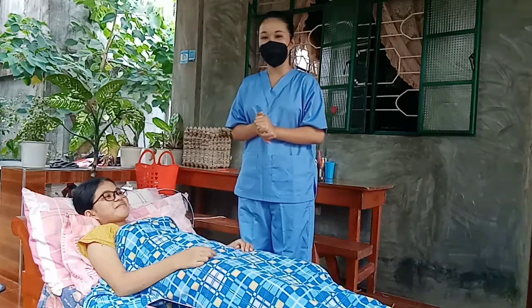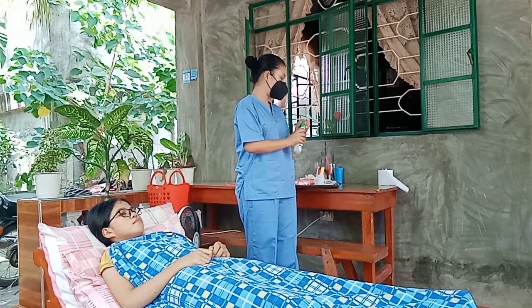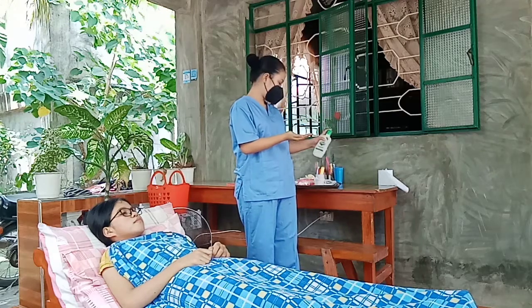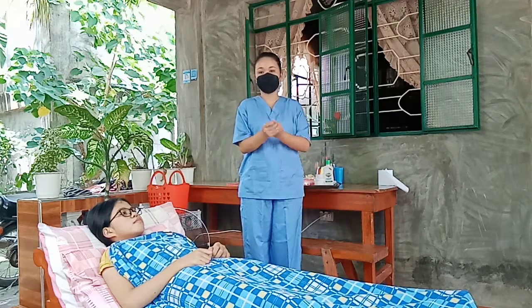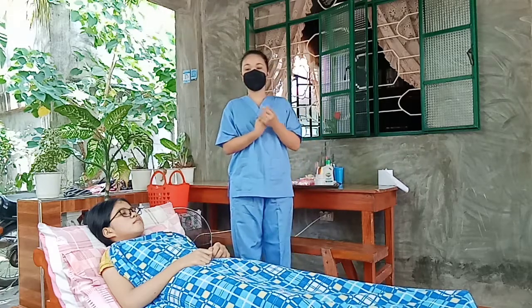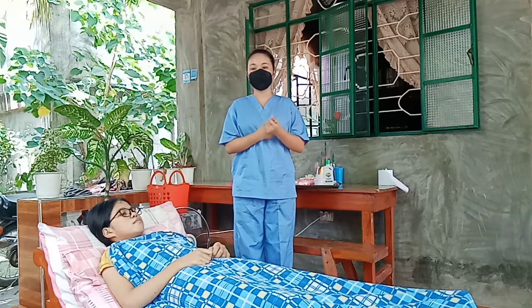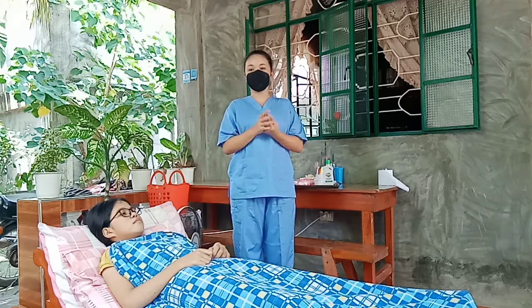So next is planning. Number 1 is identify the expected outcomes. Then next is implementation. Number 1 is perform hand hygiene. Then next is check the labels and complete laboratory requisition for containers. Number 2 is provide privacy, allow mobile patient to collect specimen in privacy. So let's assume that I already provided privacy.